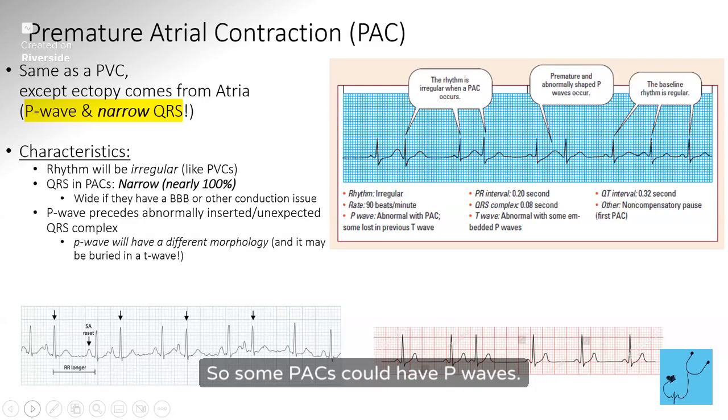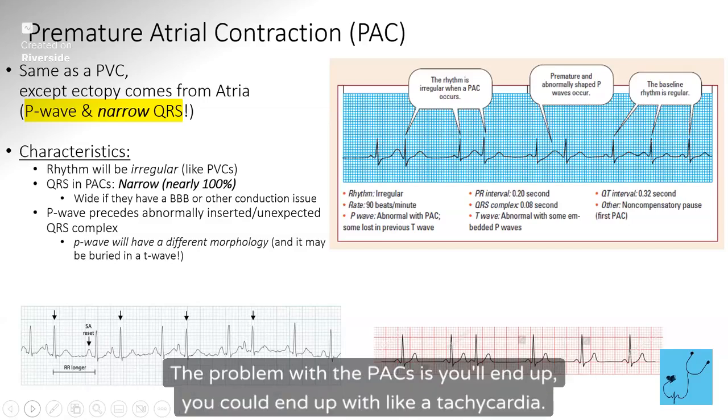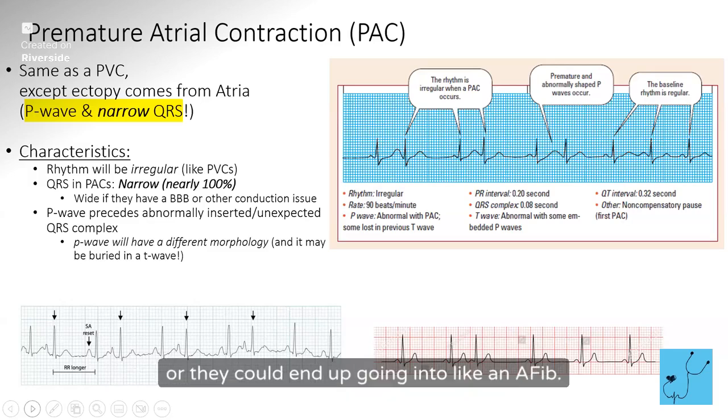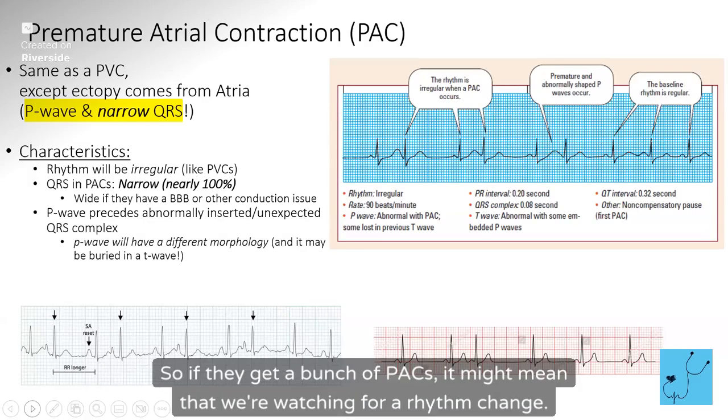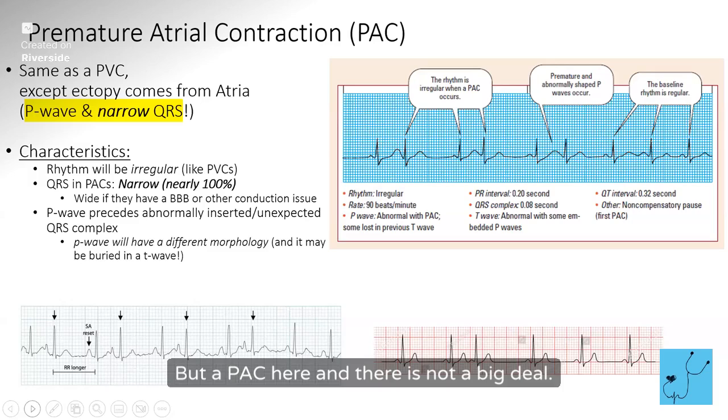So some PACs could have P waves. Right, and I think the P is just buried, so sometimes you can see it, sometimes you can't. Okay. The problem with the PACs is you could end up with a tachycardia, or they could end up going into an AFib. So if they get a bunch of PACs, it might mean that we're watching for a rhythm change. So it's important. But a PAC here and there is not a big deal.